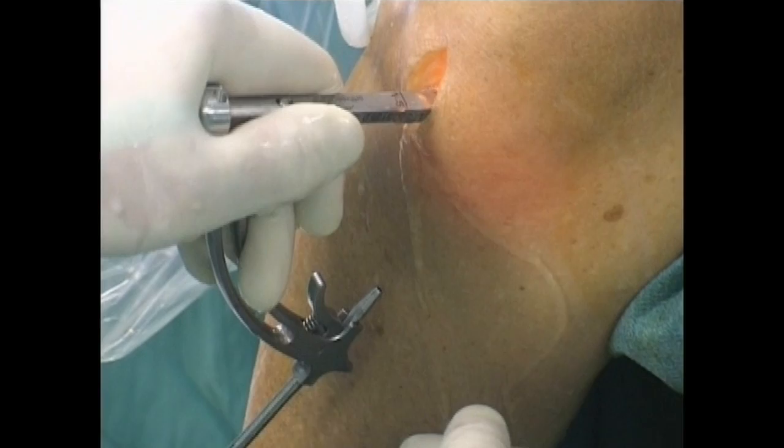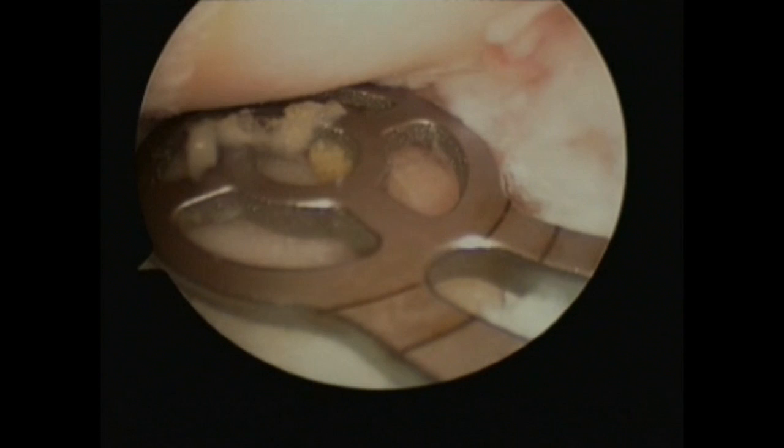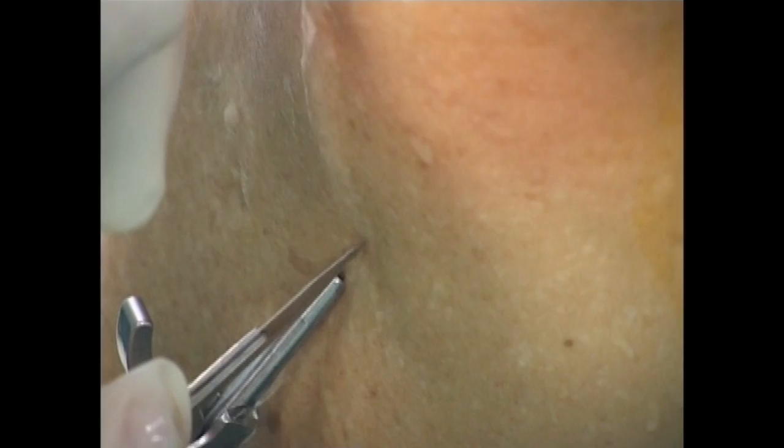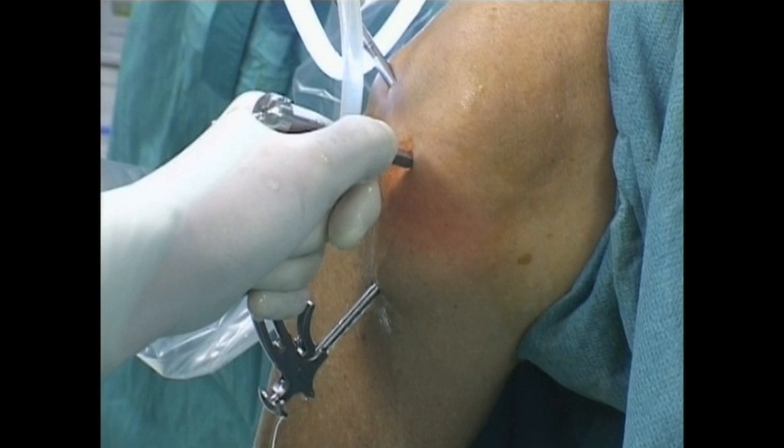With the knee in 90 degrees of flexion and valgus stress, the tibial template that best matches the anteroposterior and mediolateral surface curvatures of the tibial plateau is placed central to the damaged area. A bony rim greater than 5 mm around the implant must be maintained in order to avoid compromising tibial plateau stability and the associated risk of reaming through the anterior cortex.